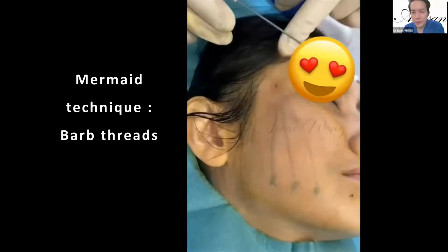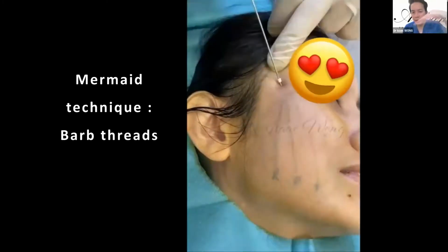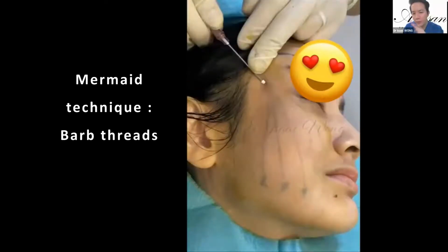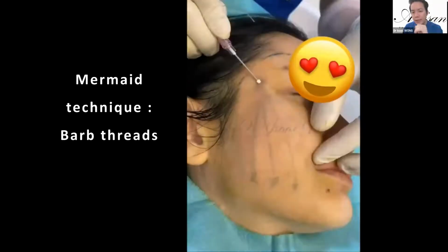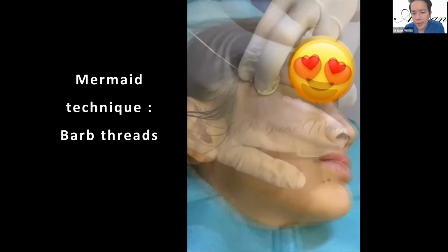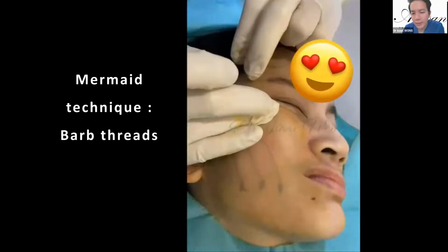Next thread. You see I aim it downwards, layer 2 first, and then after I penetrate, I go to layer 2 again, and then I place a hook near the layer 2 fat pad at the end. Again, the draping part is very important.